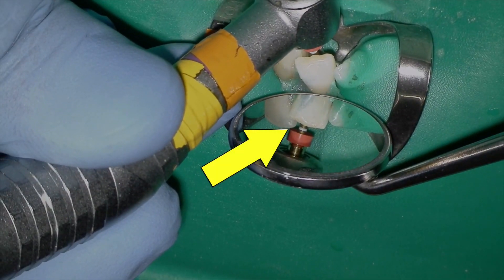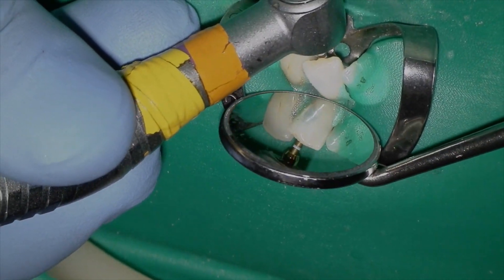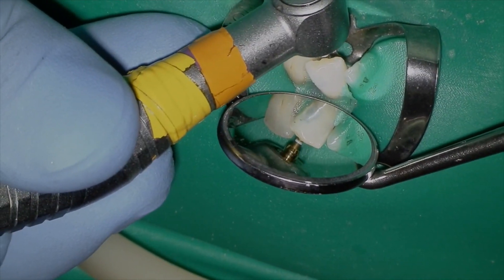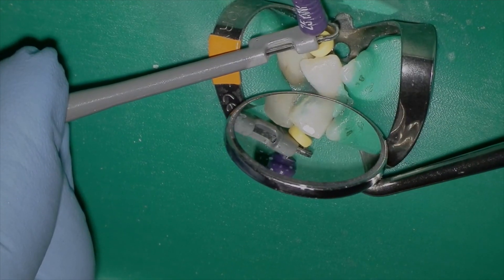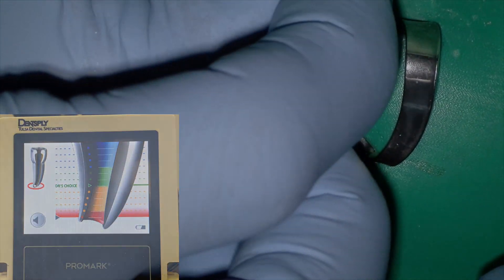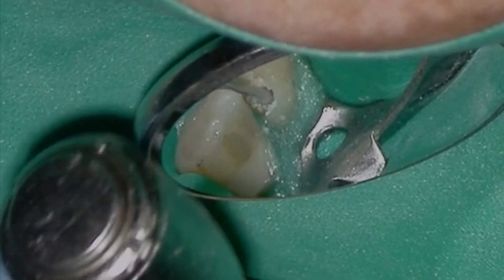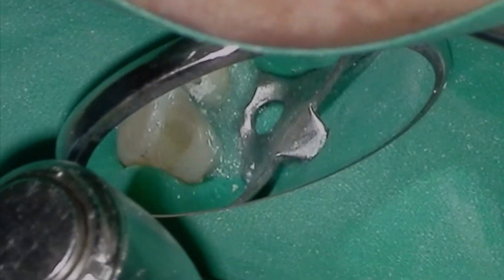Because the tooth is crowded, the rubber stop doesn't want to go all the way down. I can either extract the other tooth or take the rubber stop off and use the engraved markings on the file. The engraved markings are at 18, 19, 20, and 22 millimeters. I'm going to recheck my working length after my primary file. Mandibular incisors have a 40% chance of having two canals, and it's usually the lingual canal that's missed — the access preparation isn't brought lingual enough.